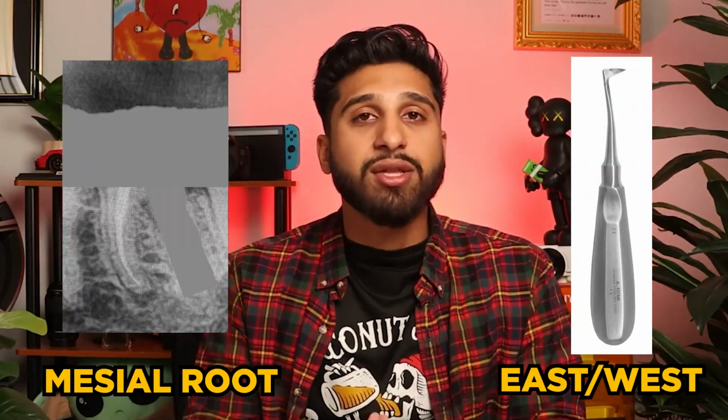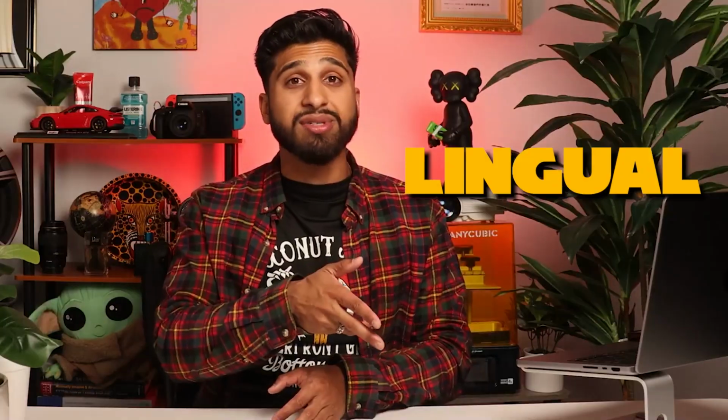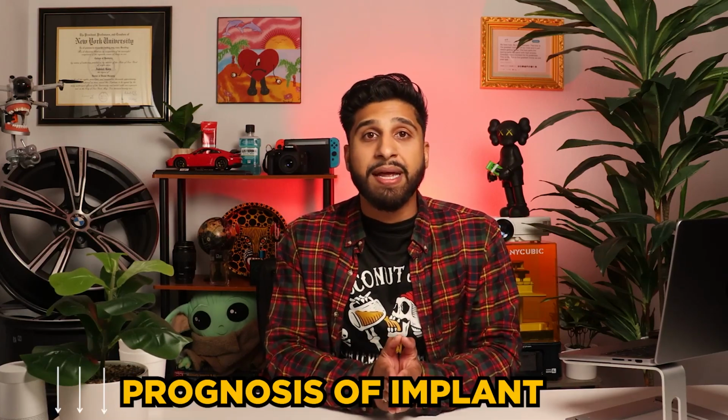After attempting to extract the root tip with the East-West and other tools, I didn't have any luck. Therefore, the next step is to carefully evaluate the proximity to the inferior alveolar nerve and see if using a surgical handpiece would be a safe option here. Proceeding with caution, I drilled away at that furcal bone to create more space for the tooth root to exit. And guys, I'm definitely avoiding drilling on the buccal or lingual side here. As we know through the research, if we are losing buccal bone, we're losing that oh so precious keratinized tissue needed for proper implant placement.